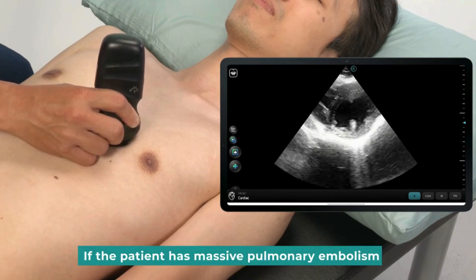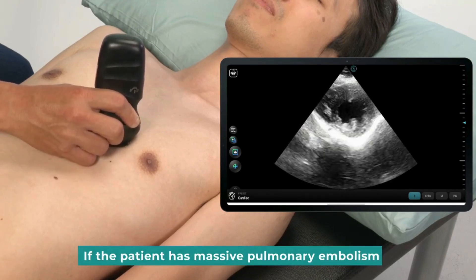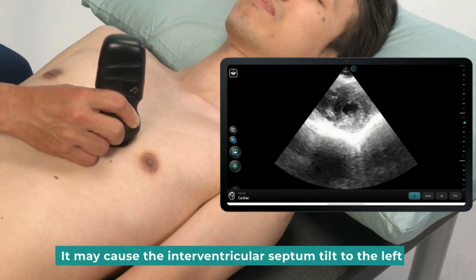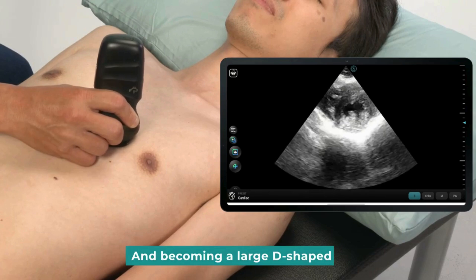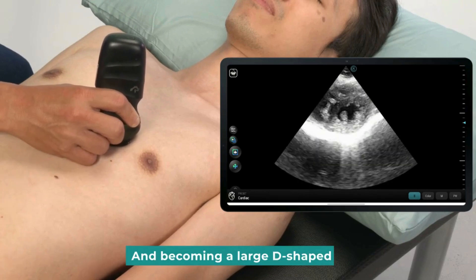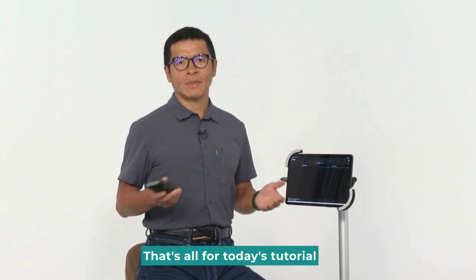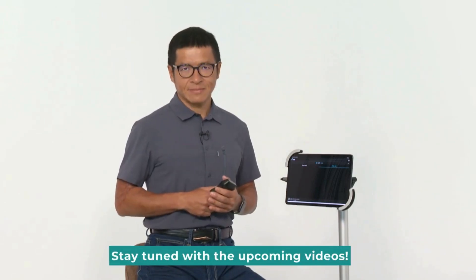If the patient has massive pulmonary embolism, it may cause the interventricular septum to tilt to the left, becoming a large D-shaped. That's all for today's tutorial. Stay tuned for upcoming videos.